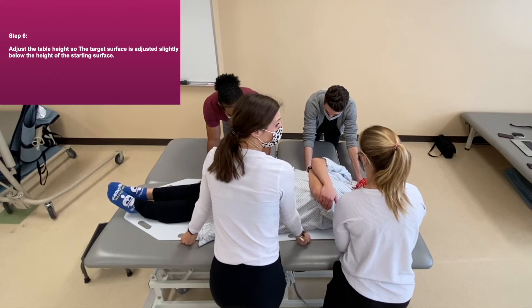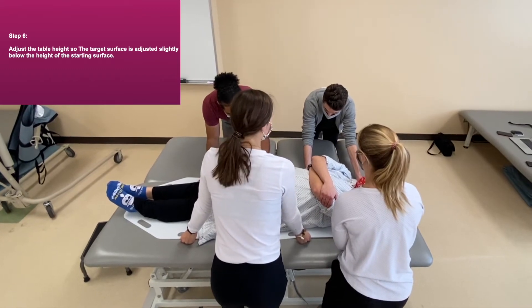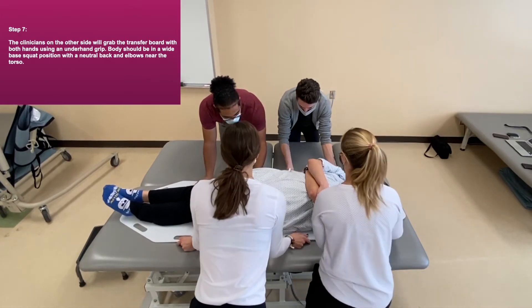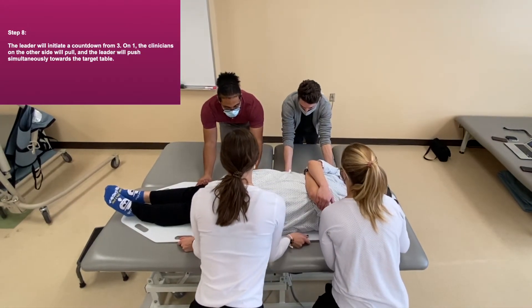Adjust the table height so the target surface is set slightly below the height of the starting surface. The clinicians on the other side will grab the transfer board with both hands using an underhand grip. The body should be in a wide base squat position with a neutral back and elbows near the torso.